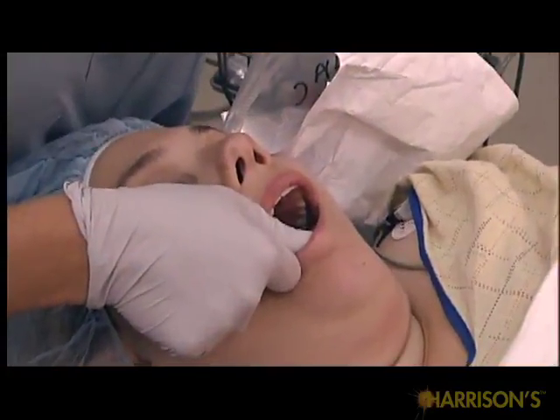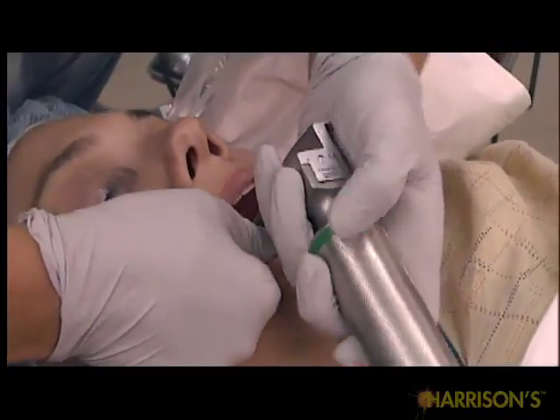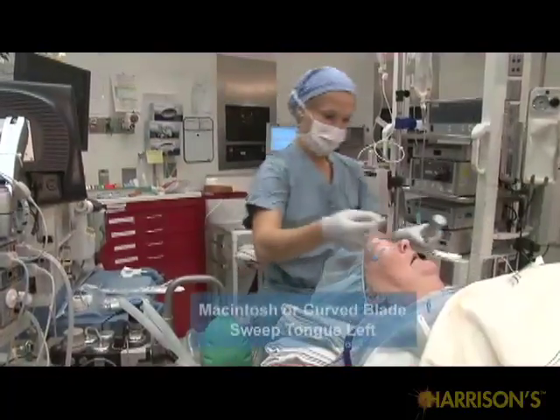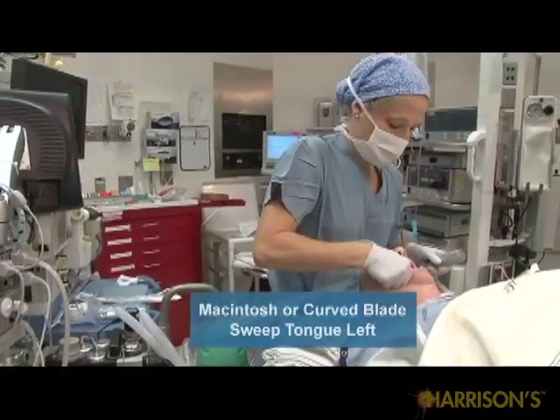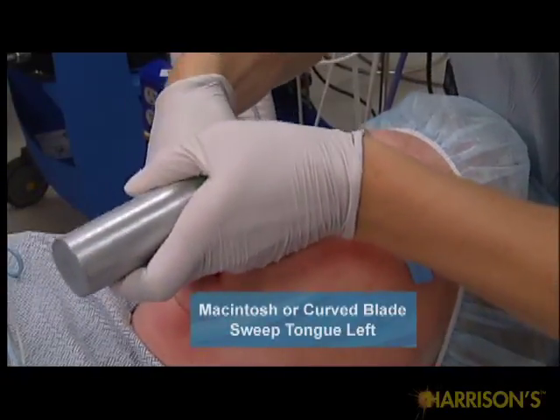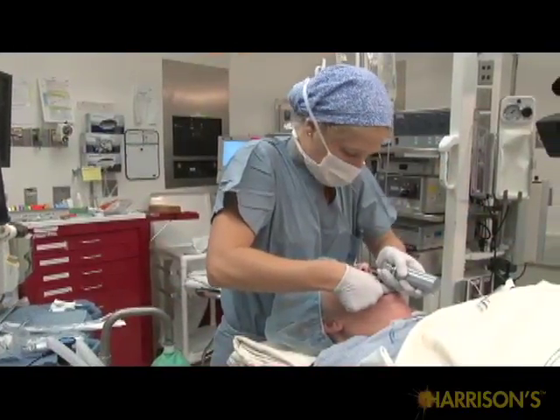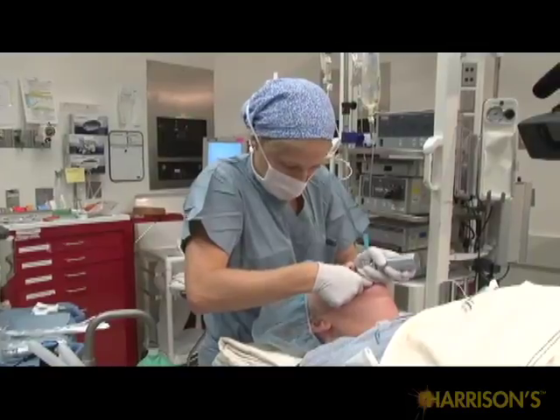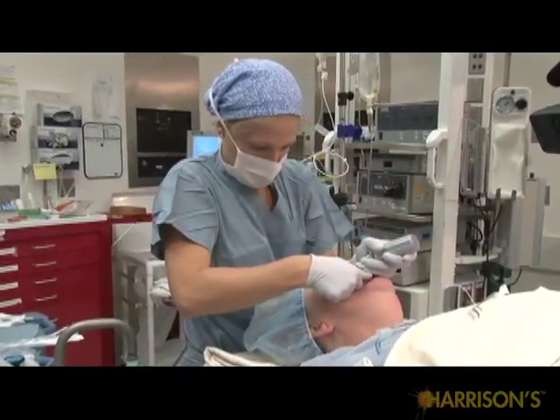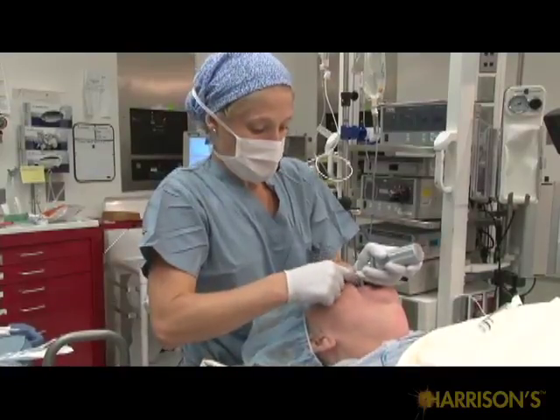Grip the laryngoscope with the left hand where the base of the blade intersects the handle, with your thumb facing up on the handle. When inserting a Macintosh or curved blade, place the laryngoscope in the right side of the patient's mouth and sweep the tongue to the left. Do not rock your wrist back when the blade is in the mouth, as this may injure the patient's teeth. Instead, once the laryngoscope is in the mouth, pull up and forward at an angle perpendicular to the patient's mandible.